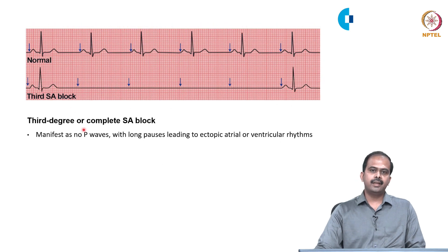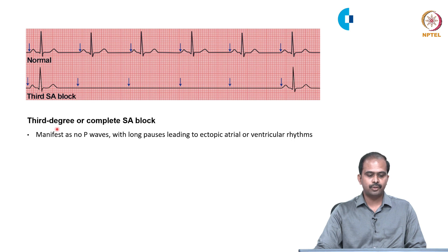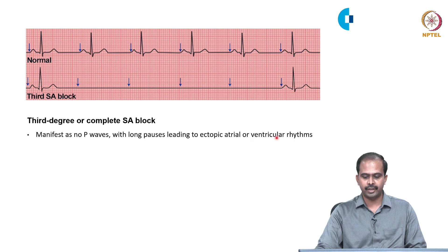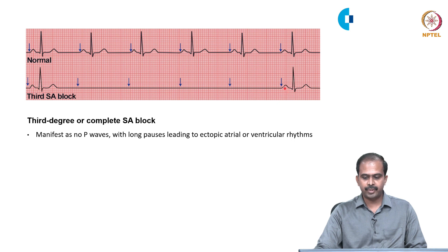Third degree or complete SA block manifests as no P waves with long pauses leading to ectopic atrial or ventricular rhythms. In this ECG, there is a P wave followed by a long pause before the next P wave appears, confirming third degree or complete SA block.